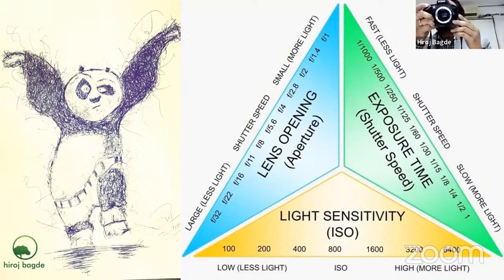Now this is, can you see? I can change that in a DSLR camera, which is not possible with some basic mobile cameras or point and shoots. But there are now very high-end mobile cameras which will be helpful for changing the exposures. But for the lens opening, that is not possible in any kind of point and shoot or mobile. So that is a big difference. You cannot play with the amount of light which should be entering inside the aperture.